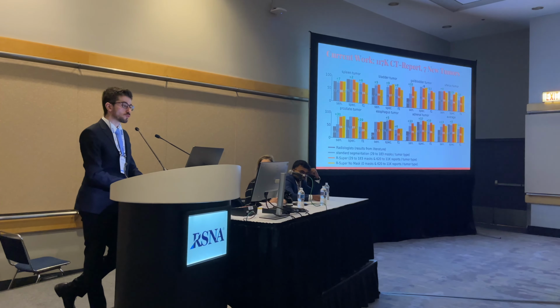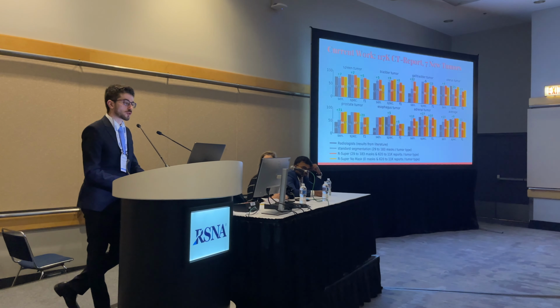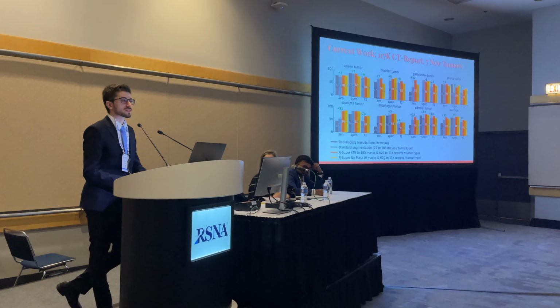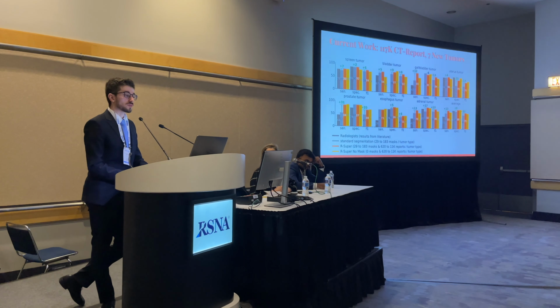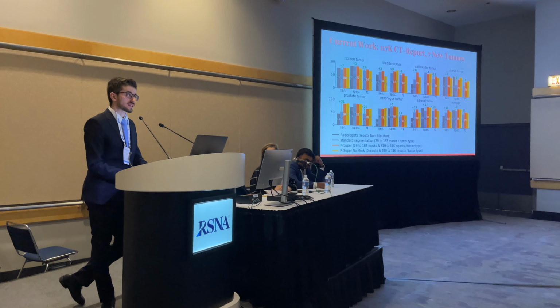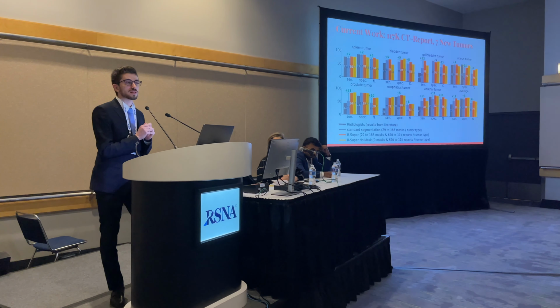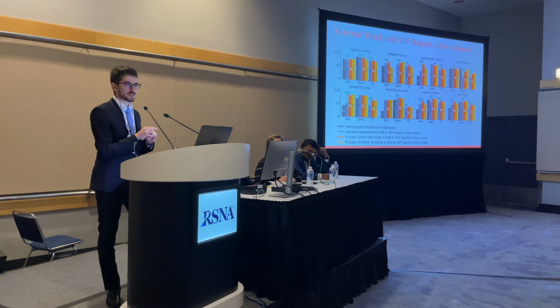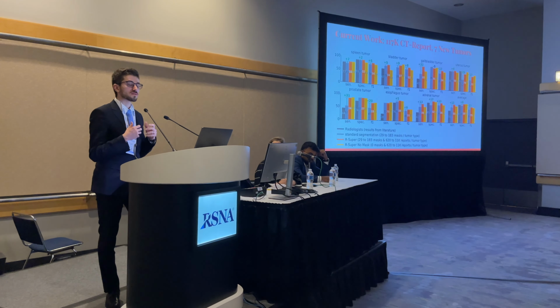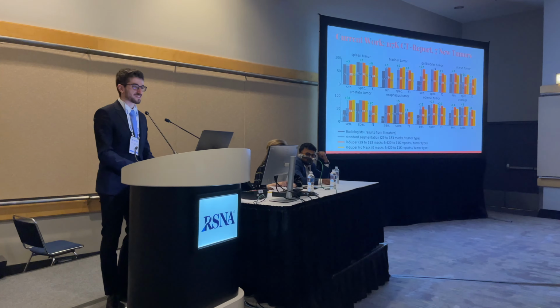Here for CT, we do work on multiple contrast phases and we see good performance in all of them. It's better in venous and arterial, but we can even have good performance in non-contrast CT. So yes, for other findings, as long as you can have a report that gives you the overall size of the disease, then it should be applicable. We can also work now in our latest version with reports that do not give a size at all. But if the reports give the size of the disease, that's very good. Thank you.